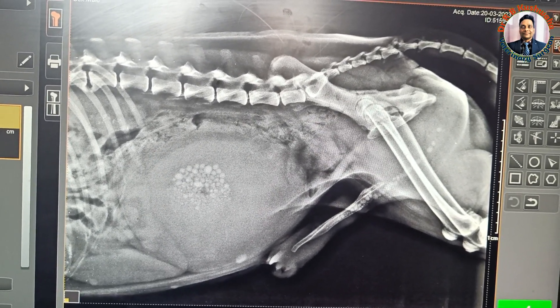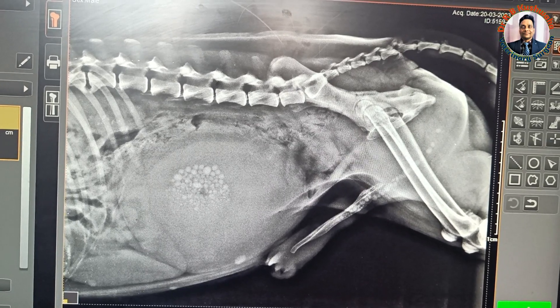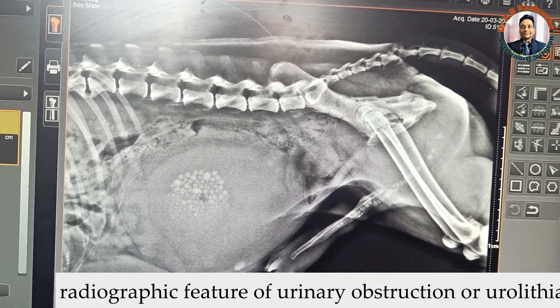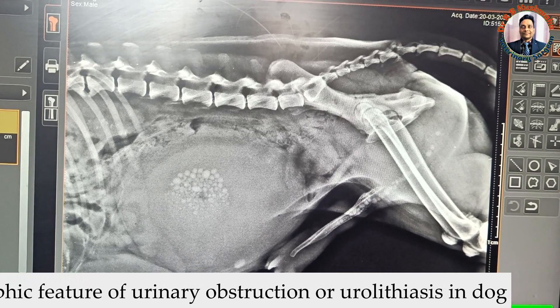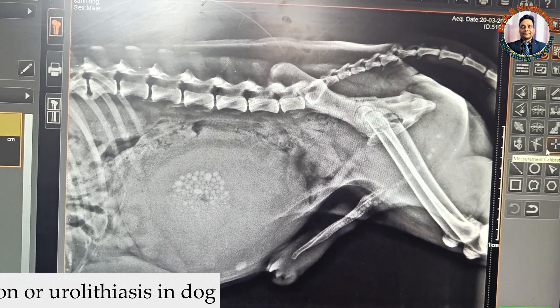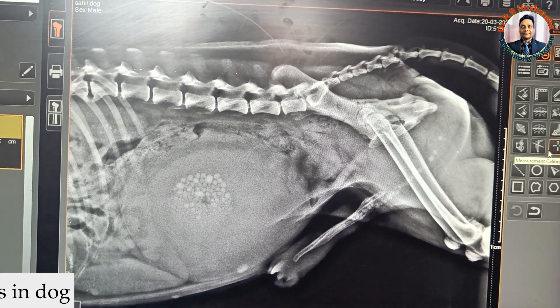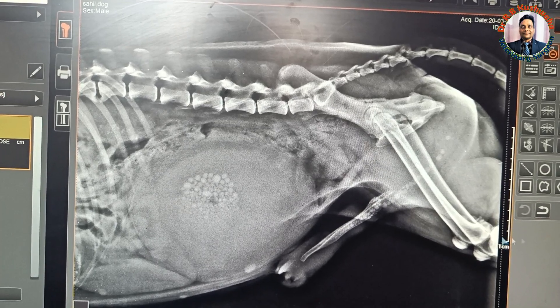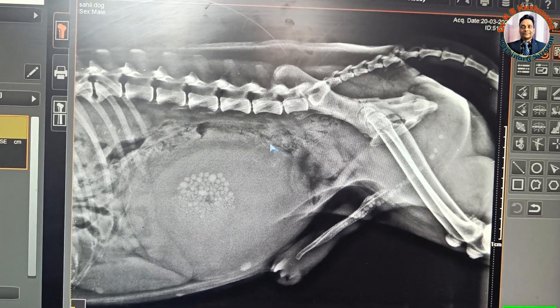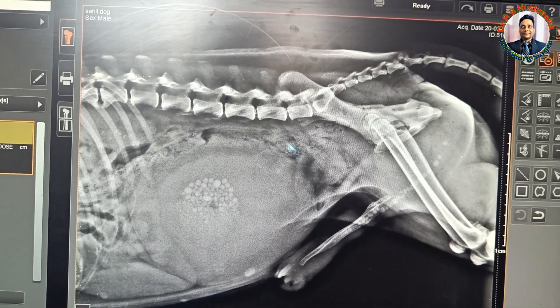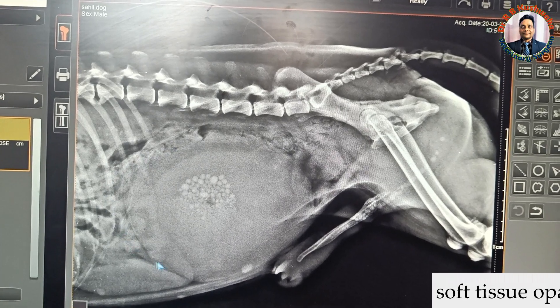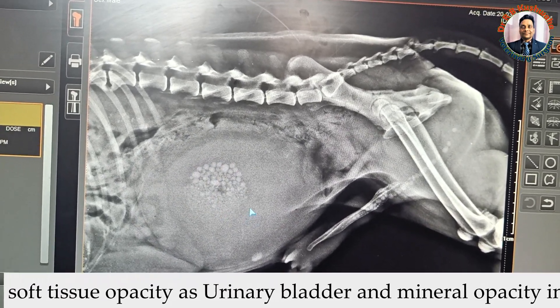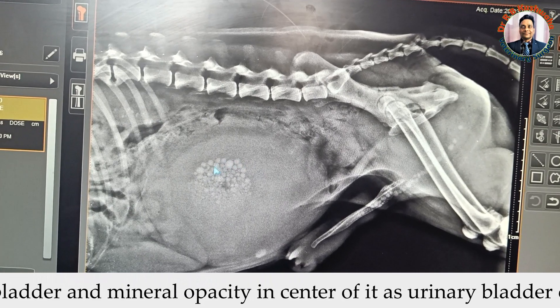Today we are going to discuss the radiographic features of urinary obstruction in a dog. This is the lateral radiograph of a dog, and if you look at it, you will find soft tissue opacity here, which has small rounded mineral opacities at its center.